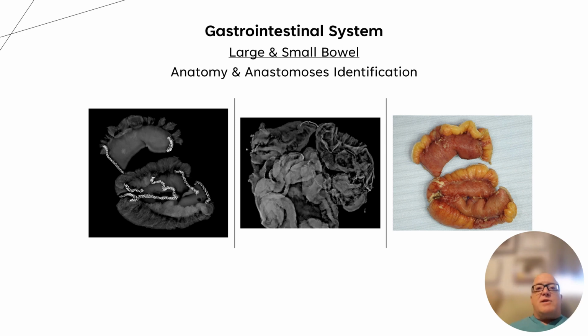The GI system. So, surprise, but large and small bowel anastomoses are not always as easy to identify grossly, especially for new, like I said, residents and PA students. We get these from time to time for either an anastomotic leak or a stricture, and you get this bowel. It's really tortuous and all stuck together. You're like, well, I got the margins, but what else is going on?